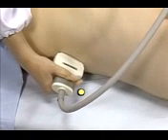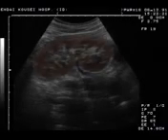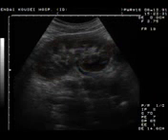How about the plane located one rib beneath, towards the toes? The left kidney comes into view. The left kidney has an elliptical or broad bean shape. Generally, the parenchyma returns a low echo and the center returns a high echo. Observe the images carefully to see if the kidney's location, size and shape are normal. Confirm that the echo level of the renal parenchyma is normal and the echo of the center is not abnormal.